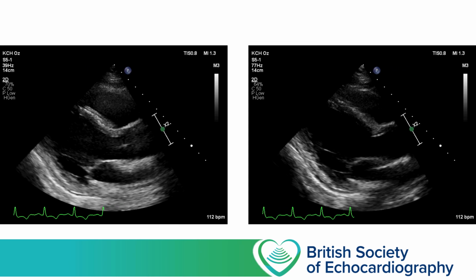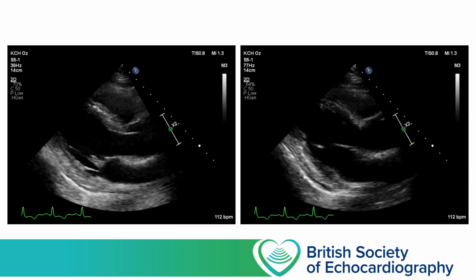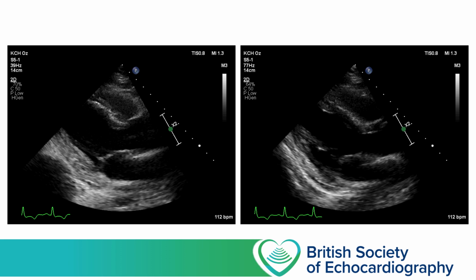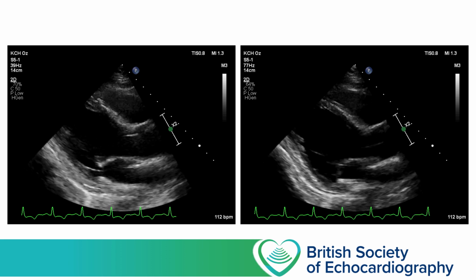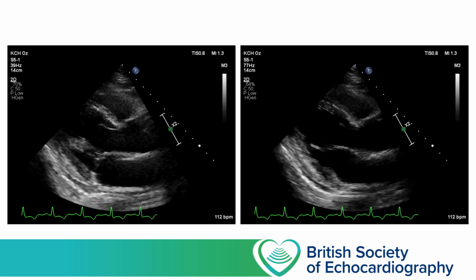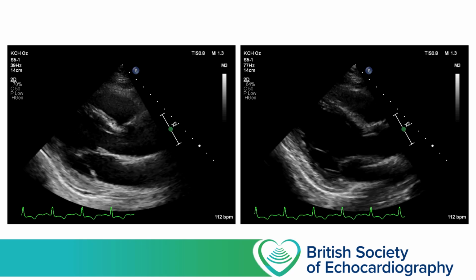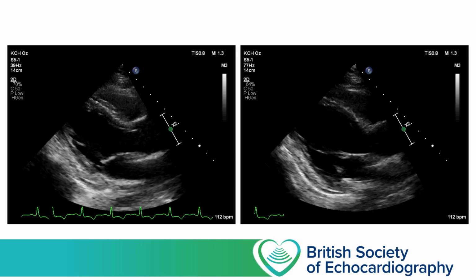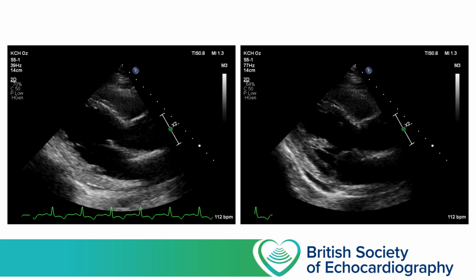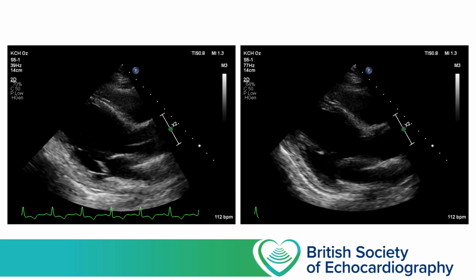Okay, so as I mentioned earlier on, some ultrasound systems, especially higher end systems, will allow you to specify whether you'd like an image that favours frame rate or favours lateral resolution. So here you can see two images side by side, both parasternal long axis of the same patient. The image on the left is produced using an increased line density, and the frame rate is just 39 frames per second. For the image on the right, we've asked the ultrasound software to favour temporal resolution, increase the frame rate, but it's done this at the expense of reducing the number of lines.